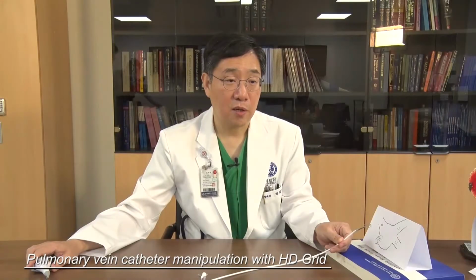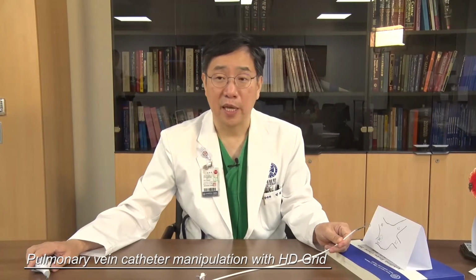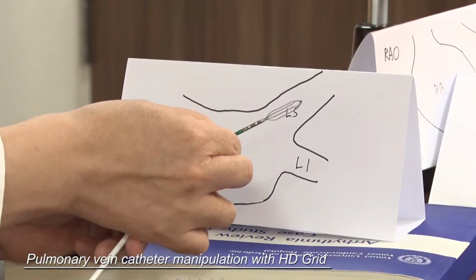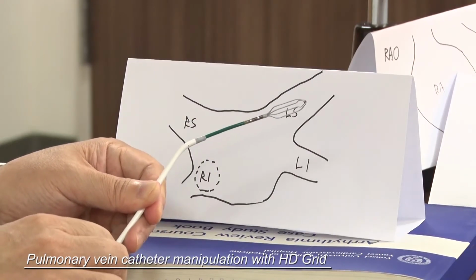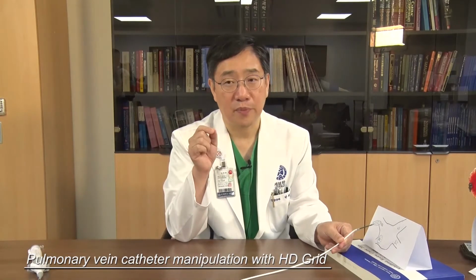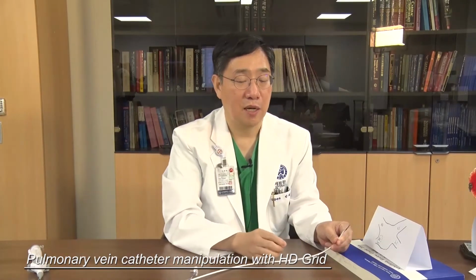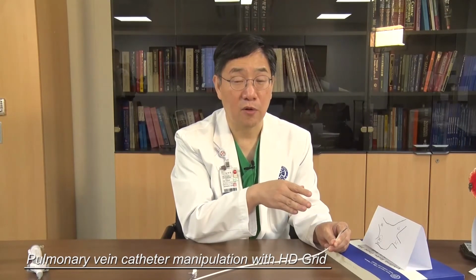The curvature to the left upper pulmonary vein and the right upper pulmonary vein is easy because it is a natural curve. So if you just push the grid catheter, if it is not the appendage side, it naturally goes to the left upper pulmonary vein. But make sure that if the catheter tip moves directly to the appendage, the tip of the catheter does not move outside of the cardiac silhouette under fluoroscopy.